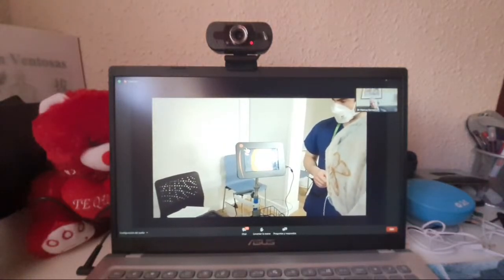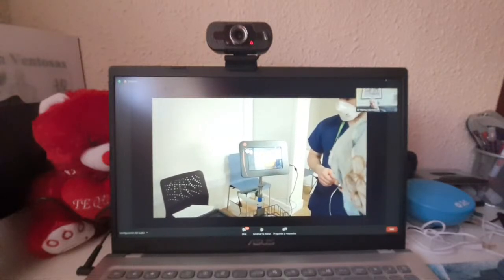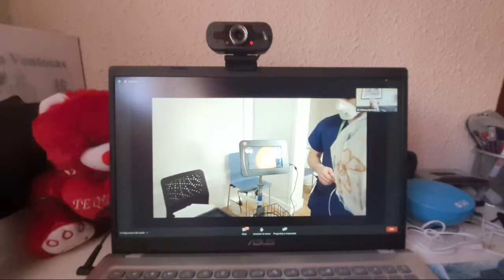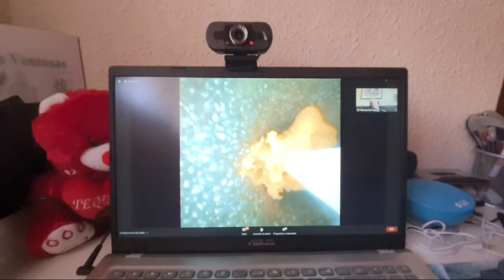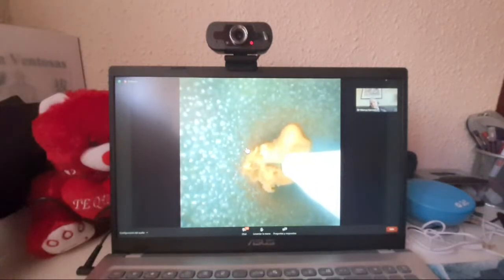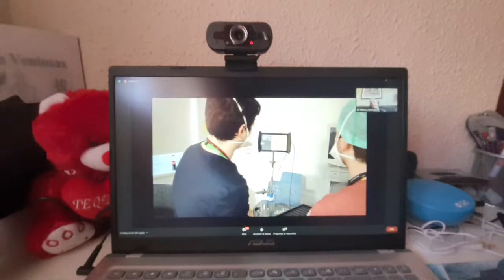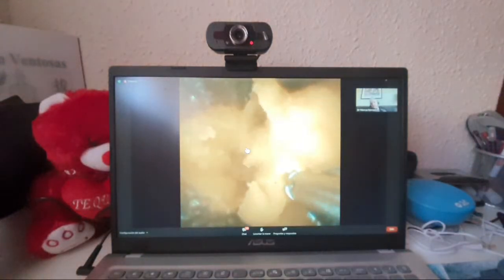So these single-use bronchoscopes are great for training. You can bring them into whatever environment you want. And this is just a physician doing a brushing. And here's an endoscopic image of a brush going out. So great for training. And then this is another doc doing a biopsy of a pseudo tumor with the Play-Doh, child Play-Doh.